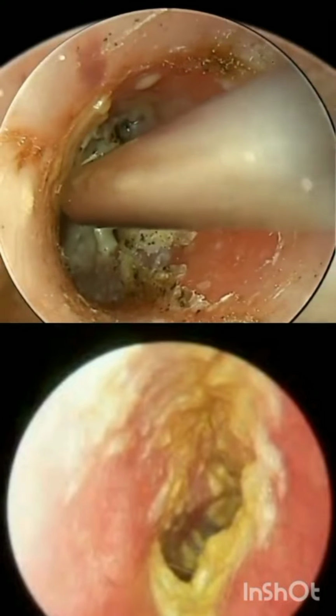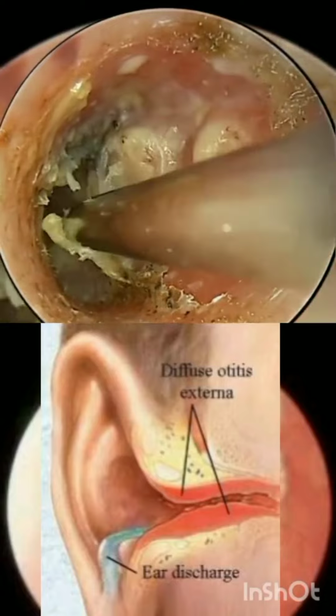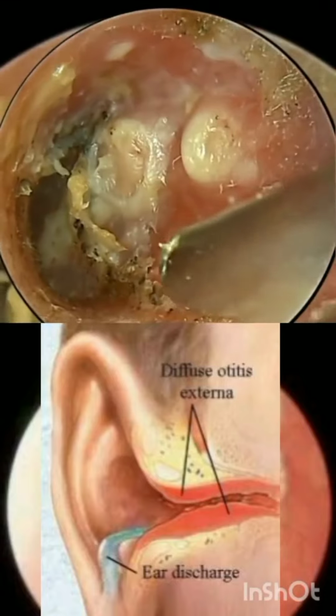So the more we suck it out, the more the ear becomes clean. Remember, you can get a lot of pus. Some pus discharges out of the ear canal.